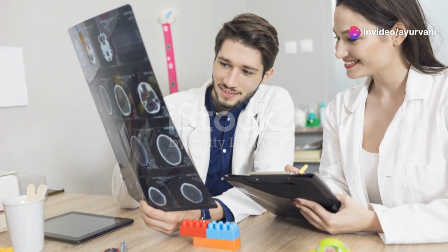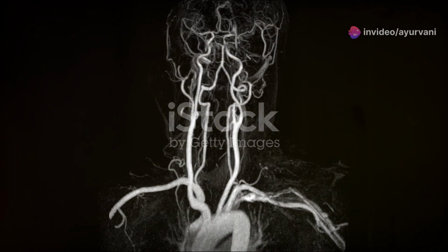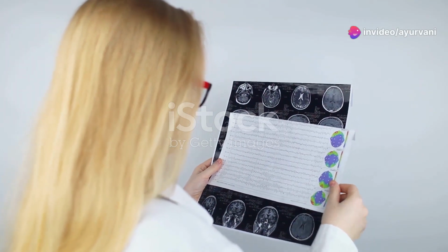Lastly, gadolinium-enhanced imaging can be useful in certain cases. It helps in identifying vascular anomalies like aneurysms or arteriovenous malformations, which might be the culprit behind the hemorrhage. Consider this when the etiology of SAH is unclear.